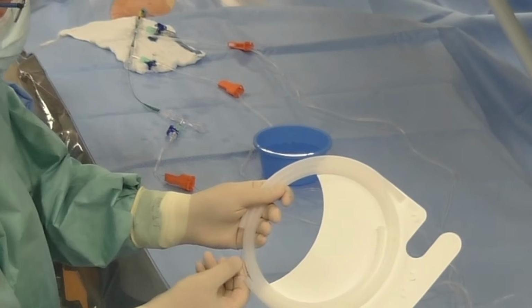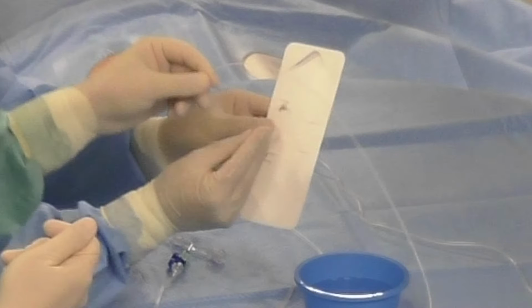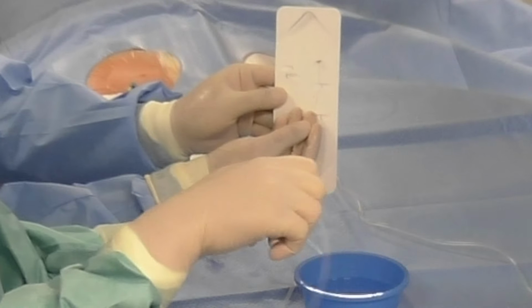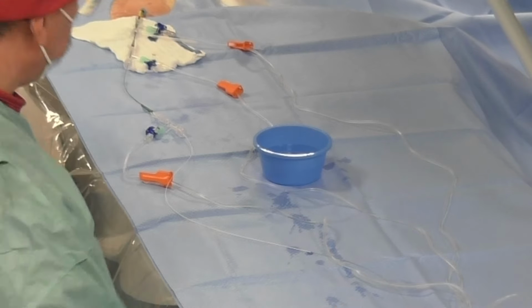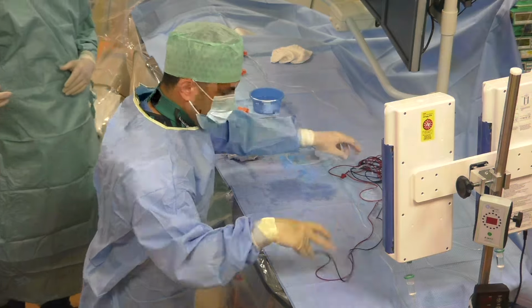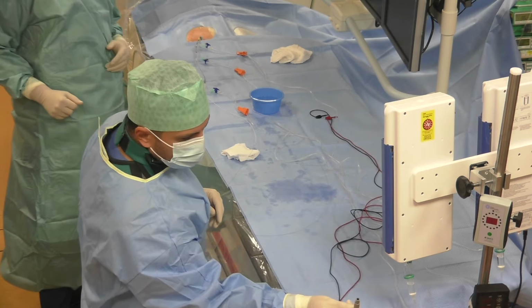And after that, we take the contour device and put it in saline to flush it. Just like that. And after that, we can insert it in the hub of the microcatheter. And here we have the sterile cables for the detachment, and we can connect them now to the detachment device. And now we insert the contour device in the microcatheter.